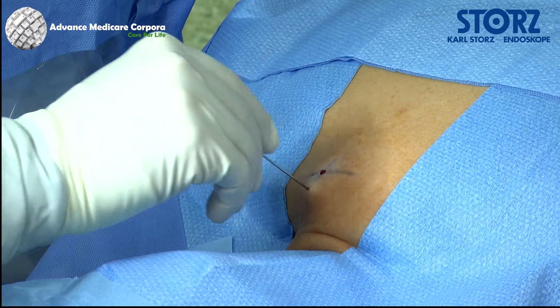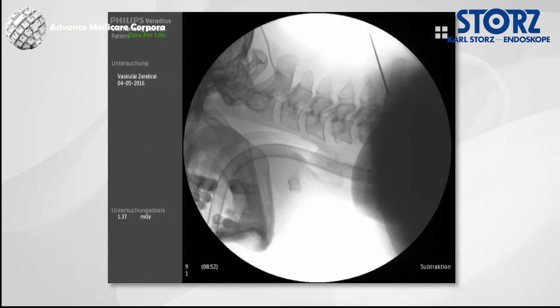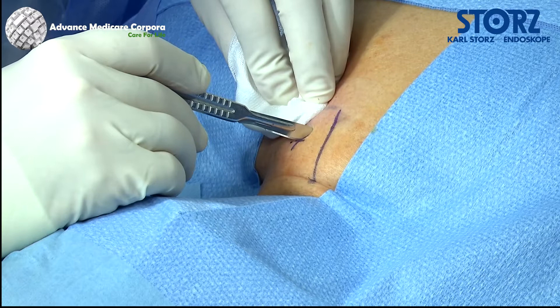For dorsal decompression in the cervical area, the patient is placed in a prone position with the skull secured in a clamp. Accurate identification of the affected segment on lateral fluoroscopy is always a priority. The midline is marked and the ideal point for the endoscopic approach to the cervical spine, directly paramedially to the spinous process, is identified.